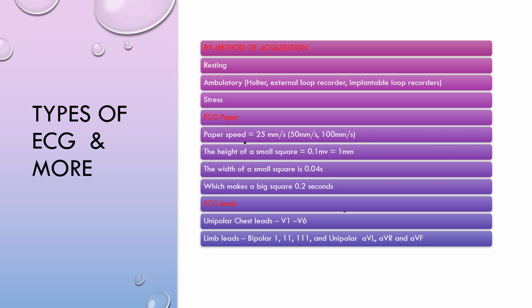We can do the Holter monitor, which a patient can wear for about 72 hours maximum. Then the event recorders, like the external loop recorder, which can go on for 30 days, 6 weeks. And then the implantable loop recorder, which is put in subcutaneously, can last for as long as 3 years. This is when the arrhythmias are really quite rare and far apart, and you still need to find it because the patient is impacted by this rhythm disorder.